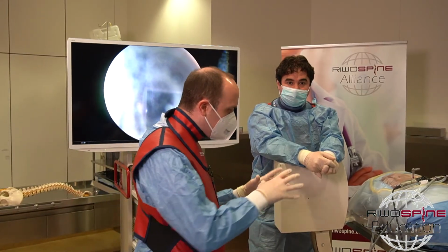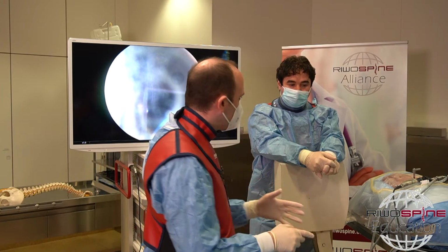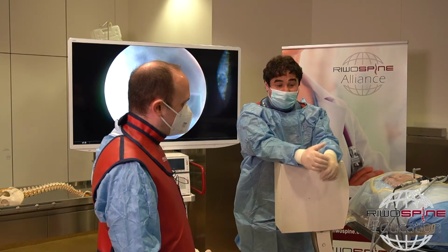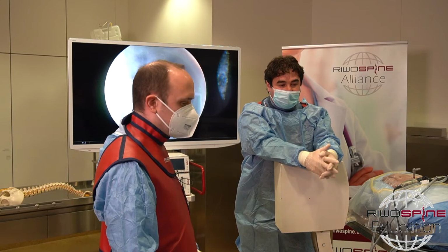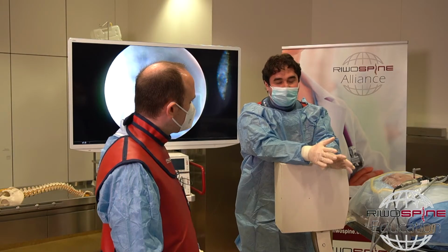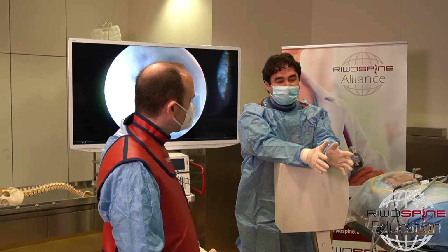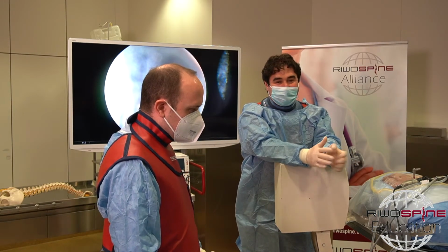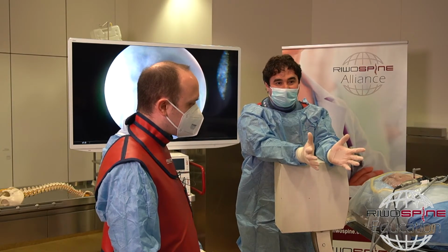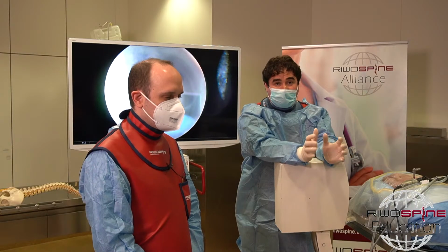We have another question. One question was coming in regarding what you said earlier, that you can work close to the neural structures with the electrode. I think there was some question left. Sure, yeah. We are working with 4 megahertz, a high frequency. The reason for that is the heat really doesn't go so deep into the tissue if you work with high frequency. Then it allows you to work very, very close to the structures. Usually the bleedings are nothing for the patient, but they are a problem for your visualization. That's why we prefer to stop all kinds of small bleedings.